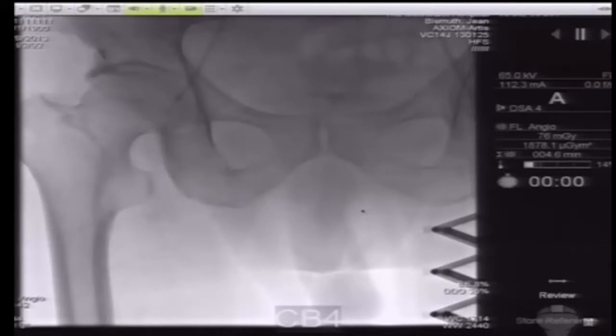What we're going to do now is shoot some dye to see where the superficial femoral artery — the artery down to the knee — is coming off. Marie is going to shoot some contrast; she'll take the wire out first, shoot some contrast through the leader. That will give us the map we want in order to get into the SFA.